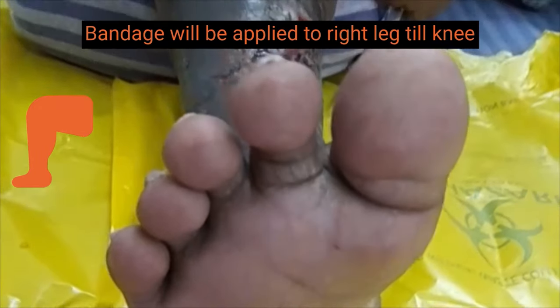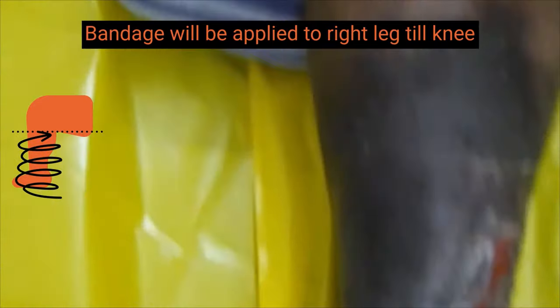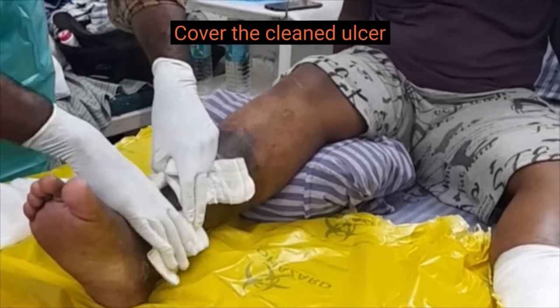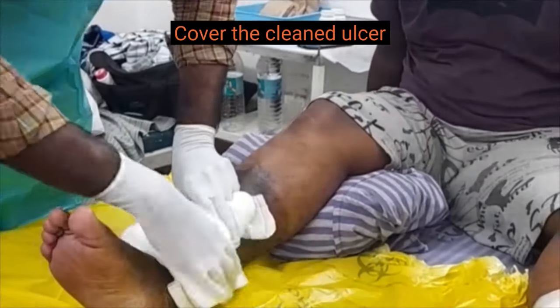A 4 layer compression bandage will be applied to the right leg to the knee. The patient has venous ulcer in both legs and ABPI in both legs is 1. Since the ulcers are large and multiple, additional gauze pads are used to cover the cleaned ulcer.